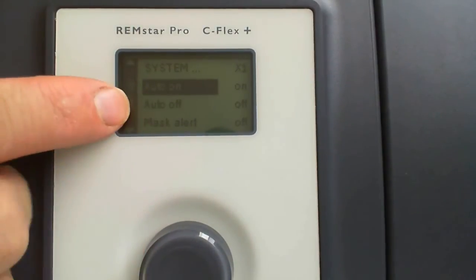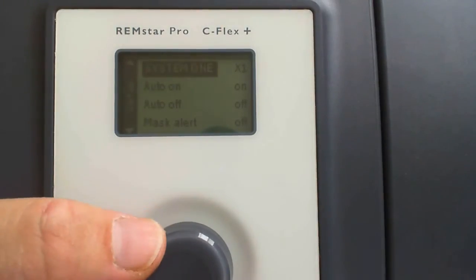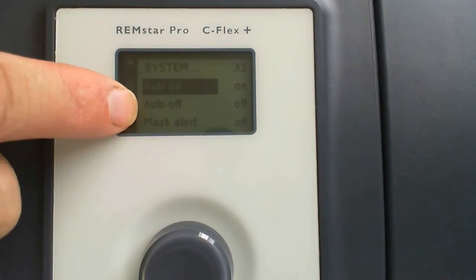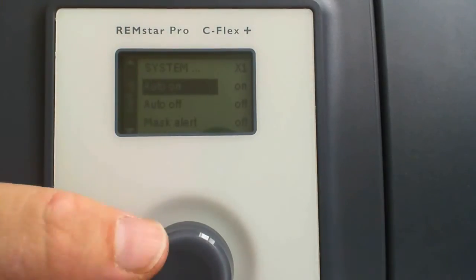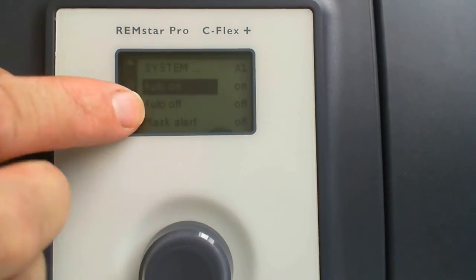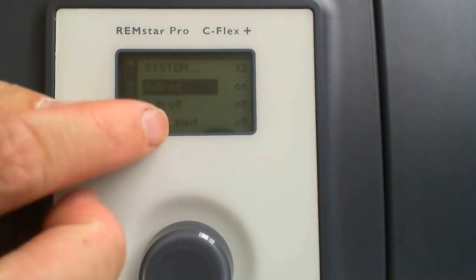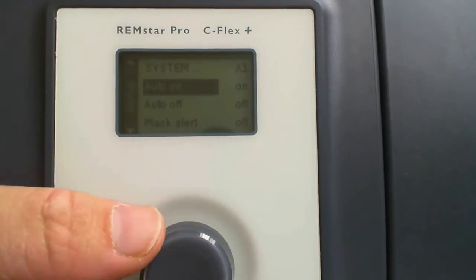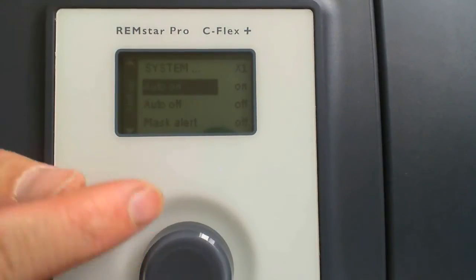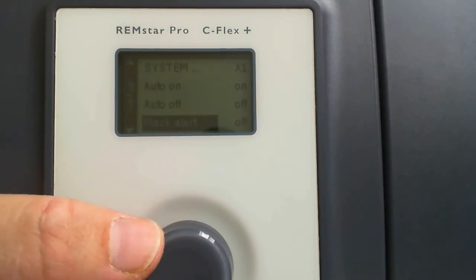So that's on. Okay, so auto off. Now auto off is if it senses a large leak during the night, or senses that you've taken your mask off and left your machine running, it'll automatically shut your CPAP off. The bad thing about this is that if you have a mask with a large leak rate, all it takes is a little leak on the side, and it'll shut your machine off at night without you knowing it. So this is one the DMEs always try and turn off, and I think it's a good idea, because some patient who doesn't know about these settings will call them in the middle of the night and say, my CPAP machine is shutting off at night and I don't know why. Well, the reason is that they had a large leak. Maybe their mask leak rate was high and they had a little leak, and the two combined pushed it over and it turned off their machine.